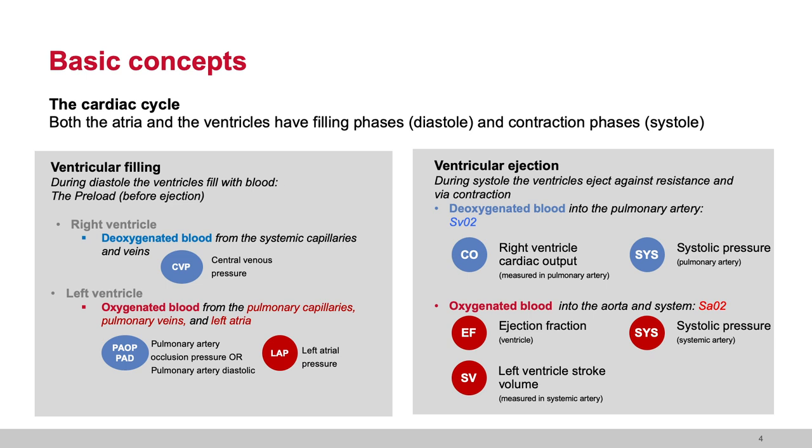ejection fraction, it actually gives us an idea, a strategic tool to evaluate the competence of the left ventricle: the amount of blood ejected divided by the amount of blood that filled the ventricle. So very important for us to appreciate that. Now, historically, we measure ejection fraction with an echocardiogram, but we do have catheters that allow us to measure ejection fraction, not necessarily of the left heart, but of the right heart.